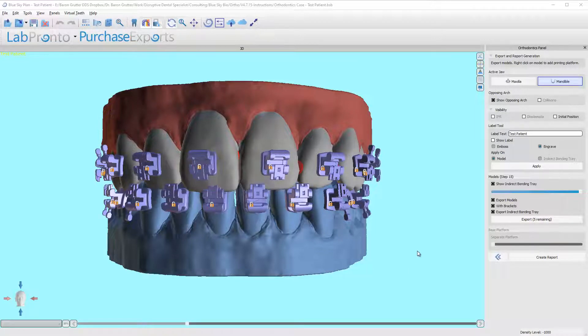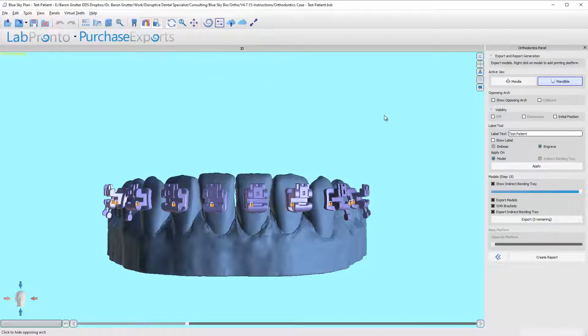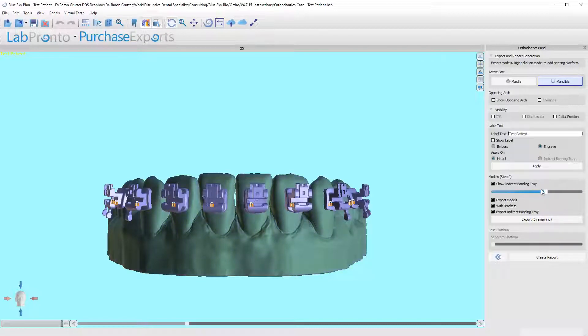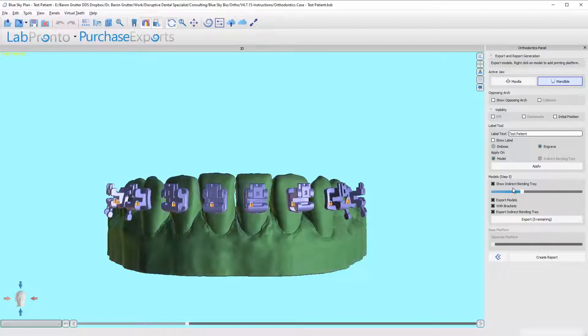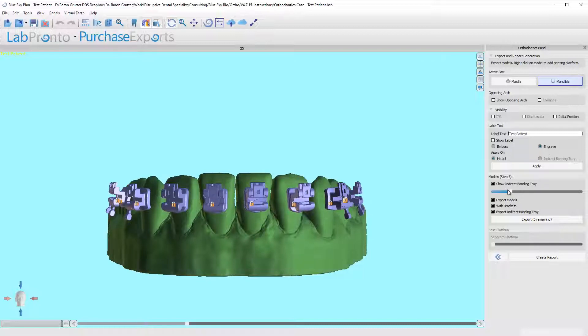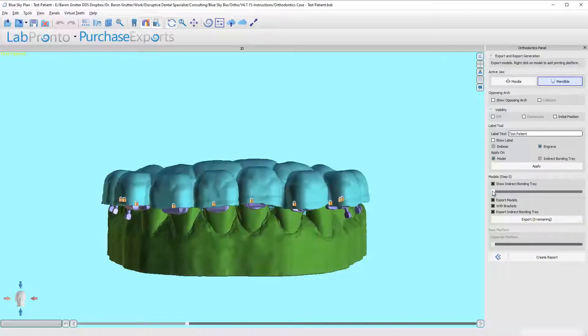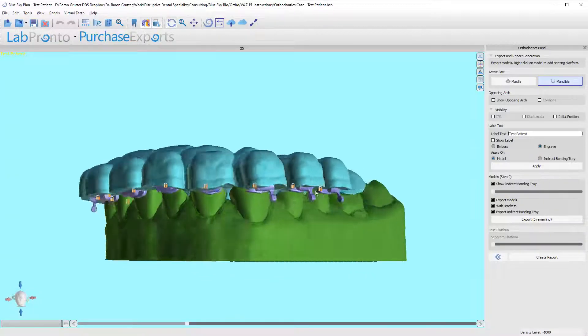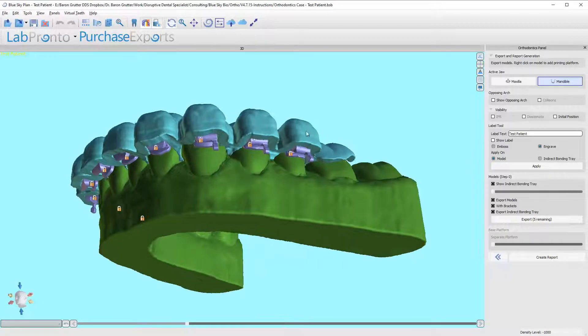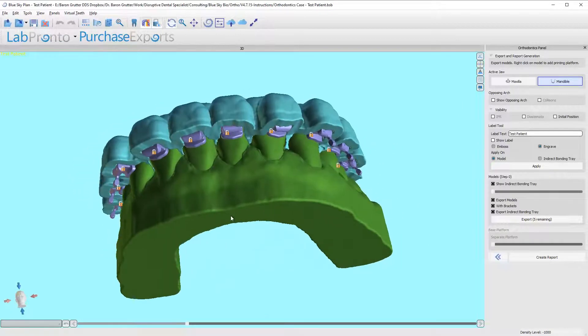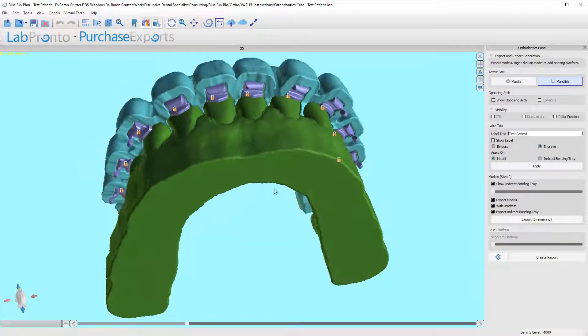Okay, so we're now at the final step and our tray is designed. If you come down here to where you have the slider bar, let's go ahead and hide the opposing so we can see the lower only. As we slide over, you can see all the models moving. That doesn't really matter because we're not printing successive models; we just need this tray.